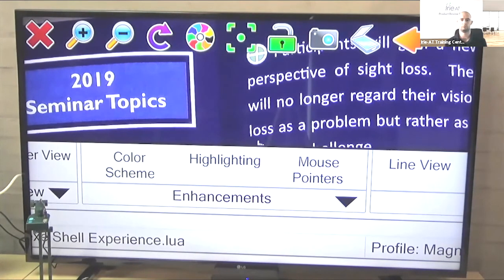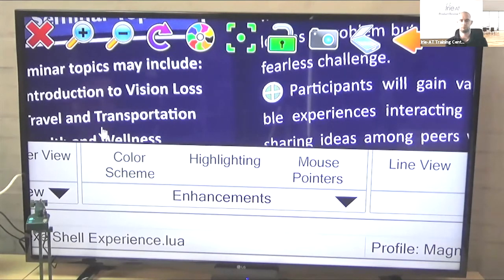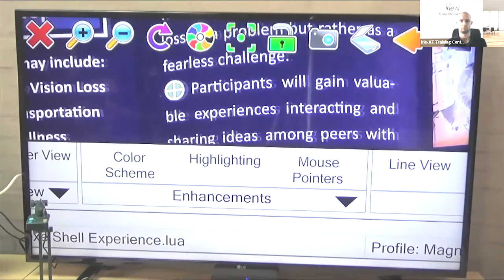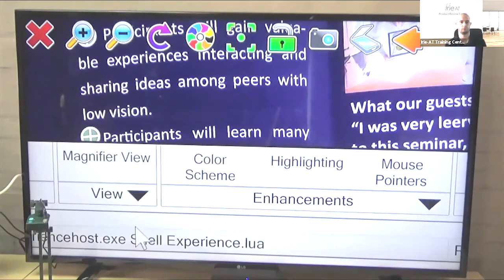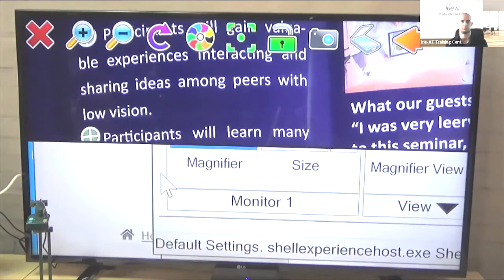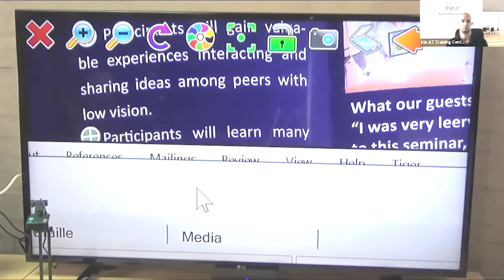And now when we're looking at something with live magnification, we really need something we can pan around in easily, but that we can also get back to our desktop and look at our notes or whatever we're doing on there. And it's especially good if you have a 55-inch TV like that. And that's lots of fun. So anything that I missed?